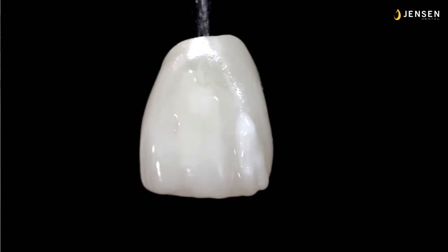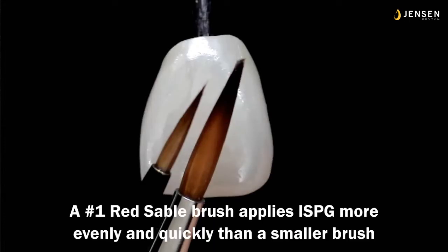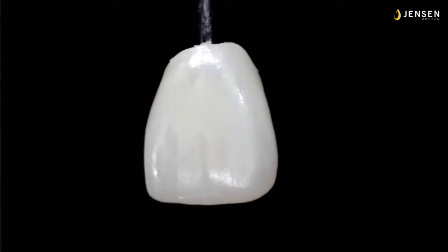But I'm going to explain to you that if you can just thin it down from that sour cream type body thickness of material and get it to where it lays kind of like a nail polish application, you will be there. So the red sable brush applies the Insync paste glaze more evenly and quickly than a smaller brush. So you could use a MiYO #2 or a MiYO #3, but the larger brush applies it more evenly. If you use it in a very parallel fashion, you'll be able to cover a whole restoration, like I said, in about 8 to 10 seconds.